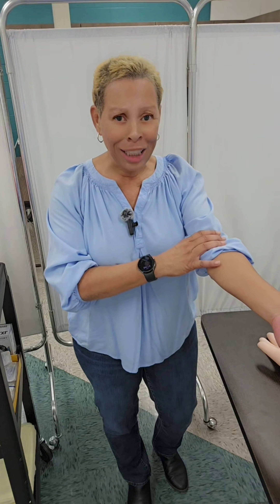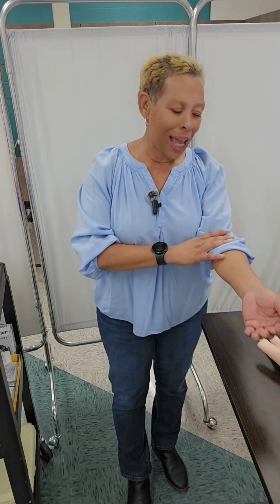There are three common vein sites to collect blood. The goodie — the antecubital fossa or the AC, the bend of the elbow. You can use that area, or the forearm, which I used in this training video, and also the back of the hand. Those are the three most common vein sites that people use to draw blood and also to initiate a peripheral intravenous line.